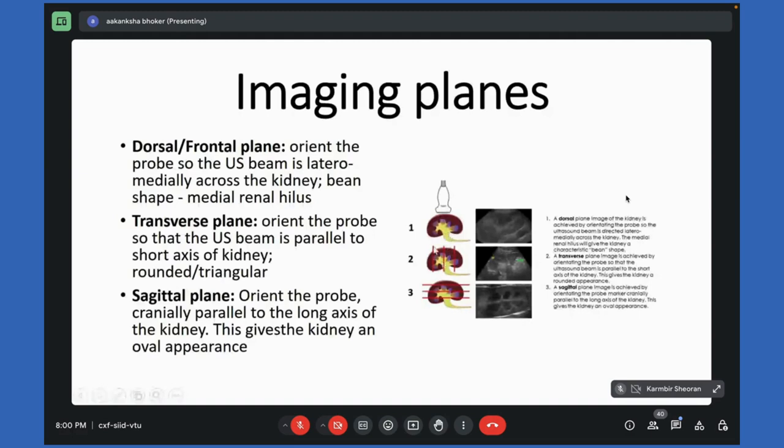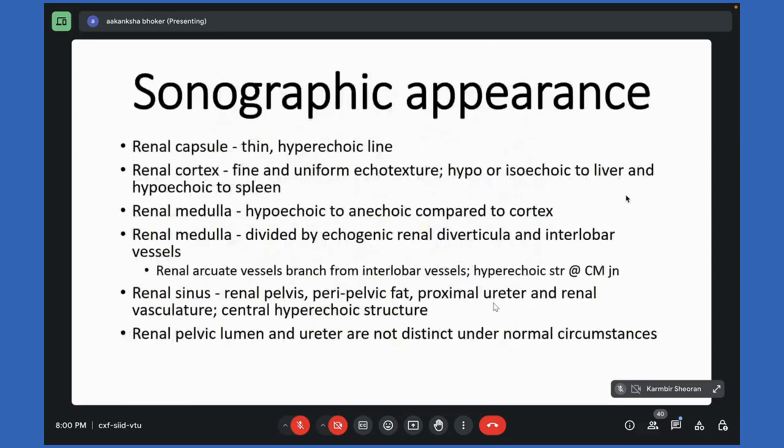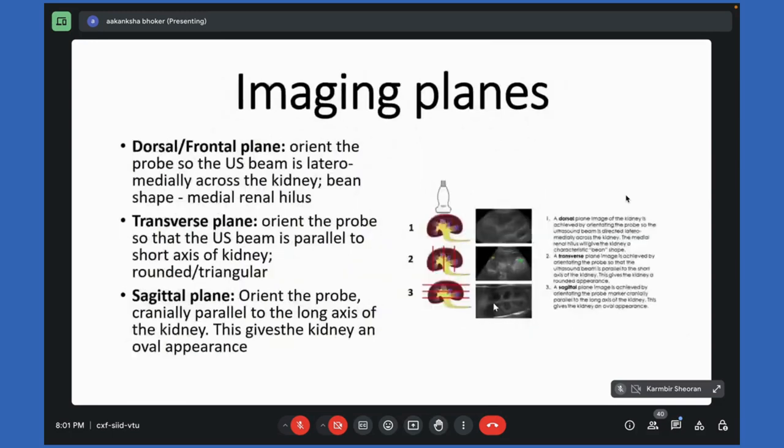In the transverse, we will see one section, and in the longitudinal, like any section, I will show how the image will appear. These are different planes. In the longitudinal plane, we will see cortex, medulla, and renal diverticula. In the transverse plane, we will see a rounded or triangular shaped structure. And in the dorsal plane, we will see bean shaped kidneys.